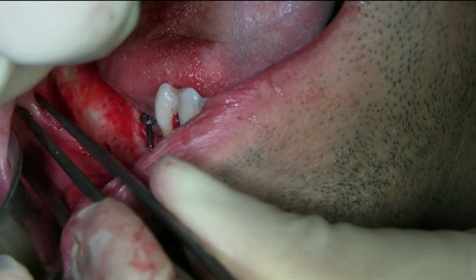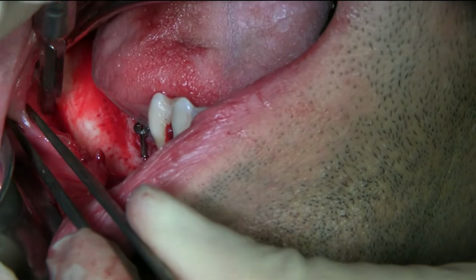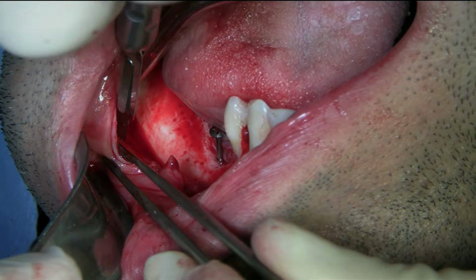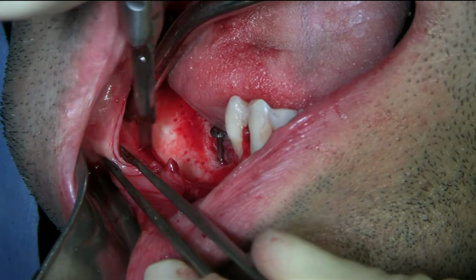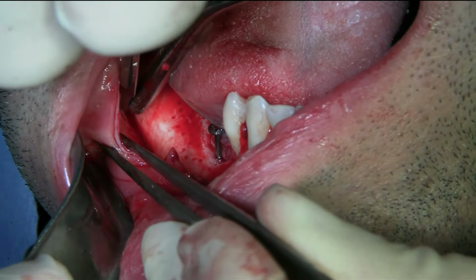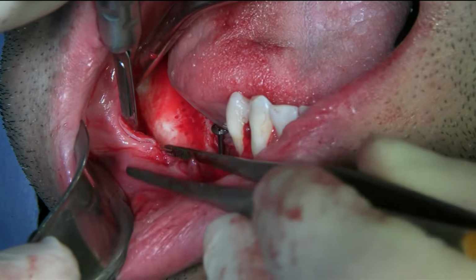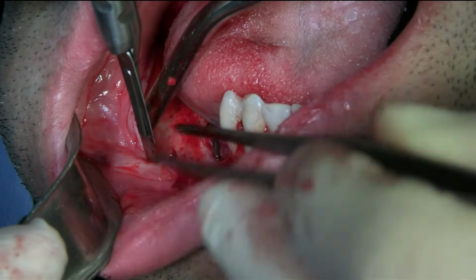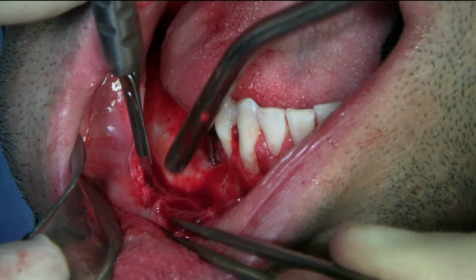I'm below the vestibular groove. Now I'm going to start to brush up. Section.